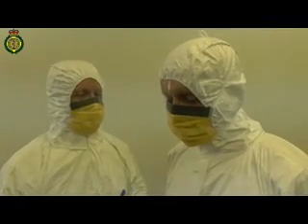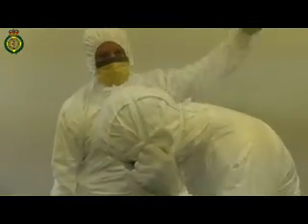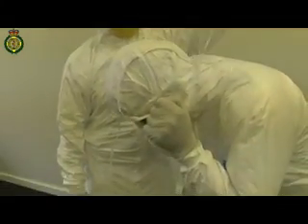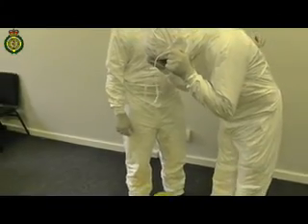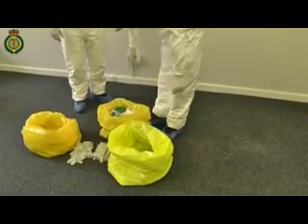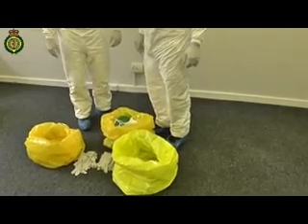Then, prepare to remove the face protection mask. You can help each other do this. If you are wearing goggles or protective glasses, remove them first. Close your eyes and tilt your head forward. Untie the straps at the back of the head. Take the mask forward, ensuring your hands don't touch any part of your face. Lower the mask into the middle clinical waste bag.